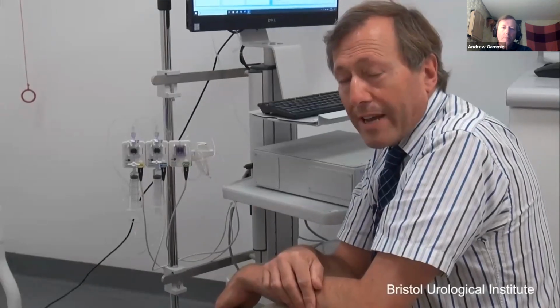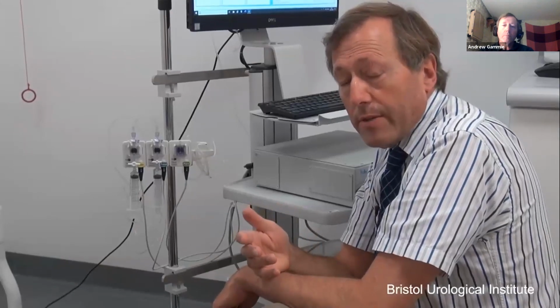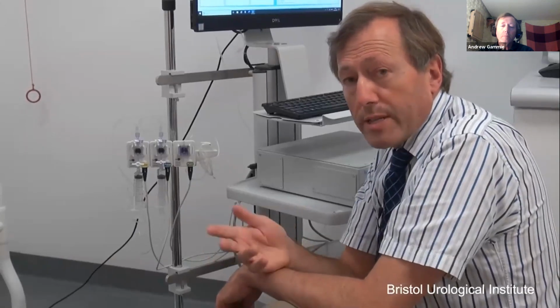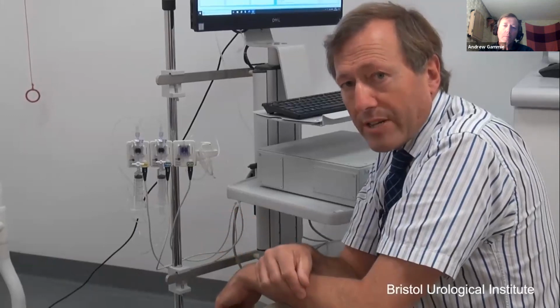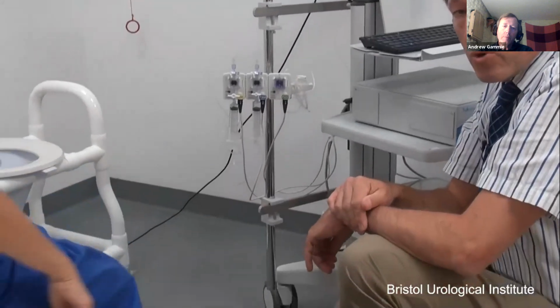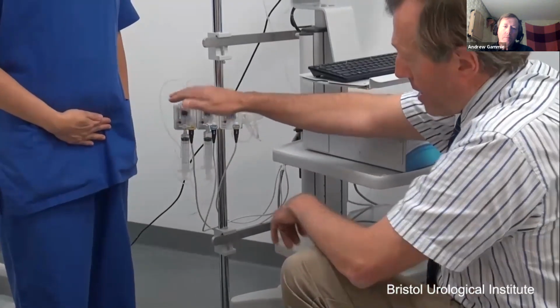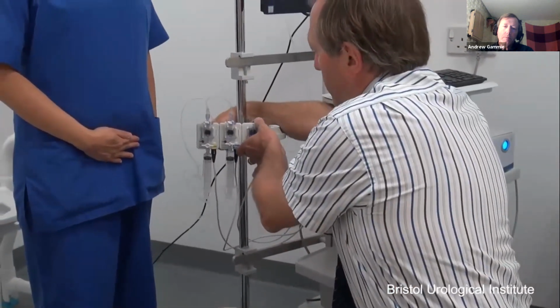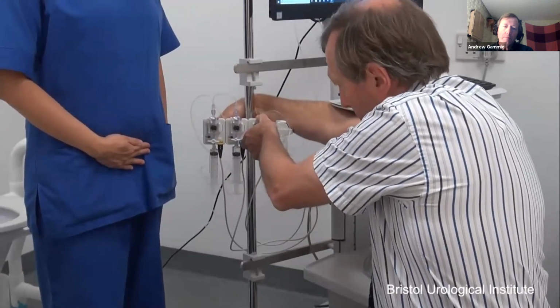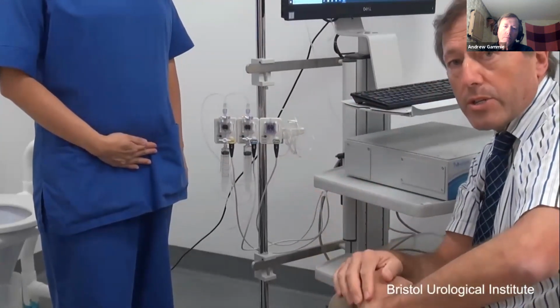So once we've checked the catheters are in place and they're all functioning correctly, we'll be asking the patient, in the case of a man, to stand up for the filling phase, or for the woman, we might have her standing up in order to do some stress tests. So when your patient is standing up, you want to make sure that you get the level of the symphysis pubis correct. Now it is up here, so I need to change the level of my transducers so that the whole of the outlet is level again with the symphysis pubis. And now we can carry out the stress tests.